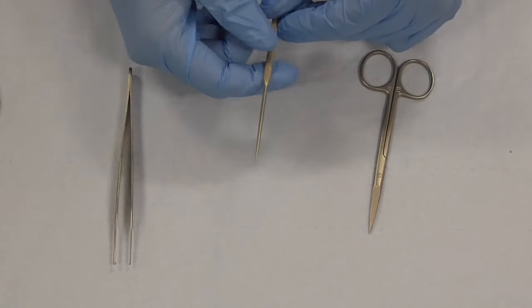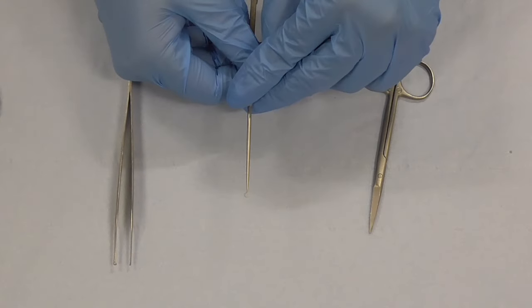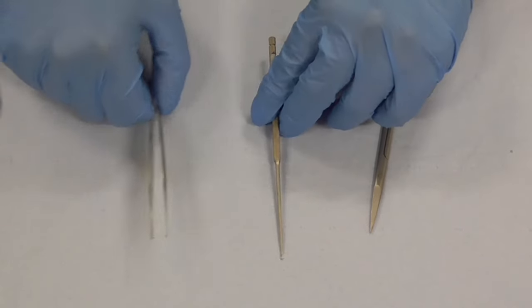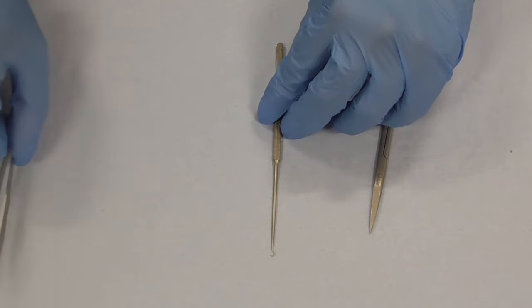However most suturing kits don't tend to have a skin hook even though it will give you the least amount of trauma to the skin. So you've got to get used to using a dissecting forceps.